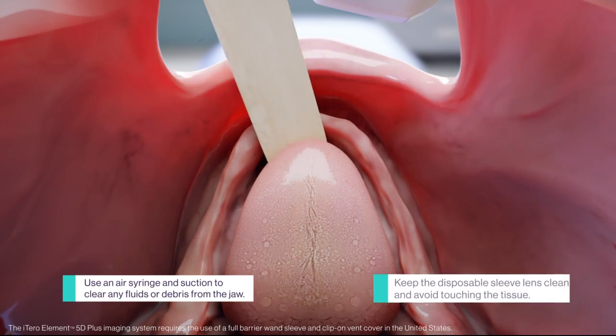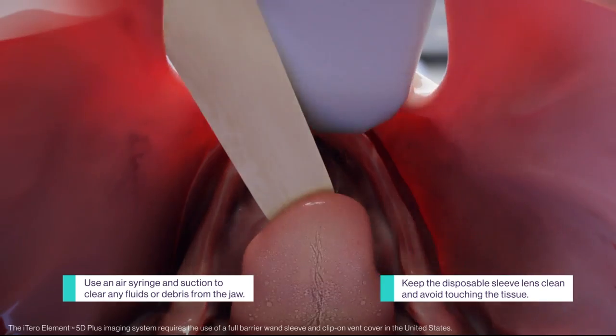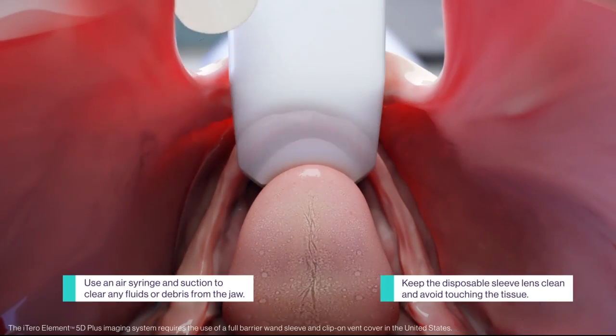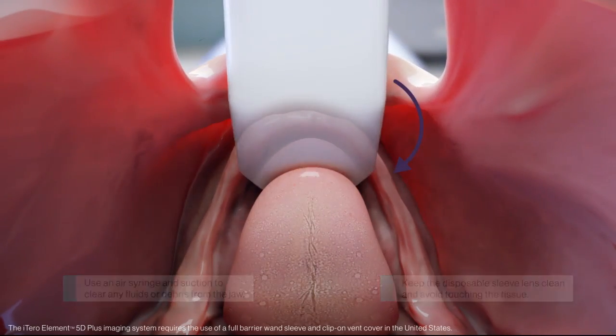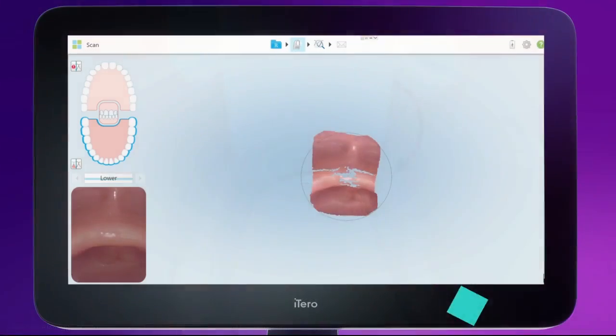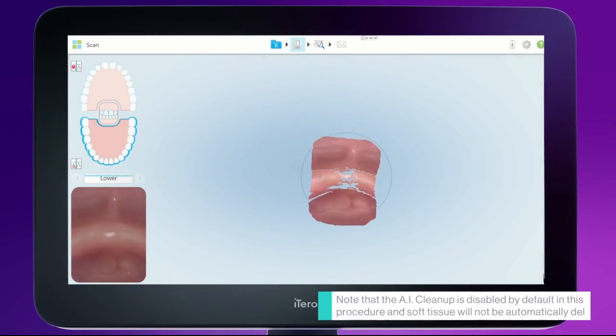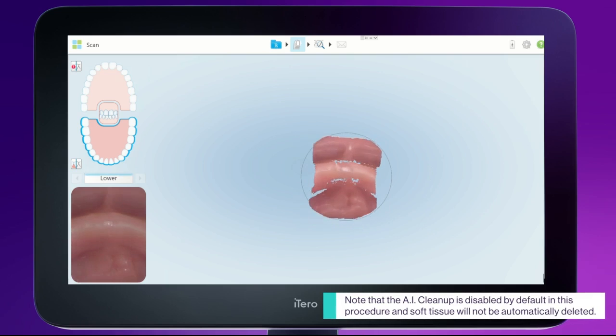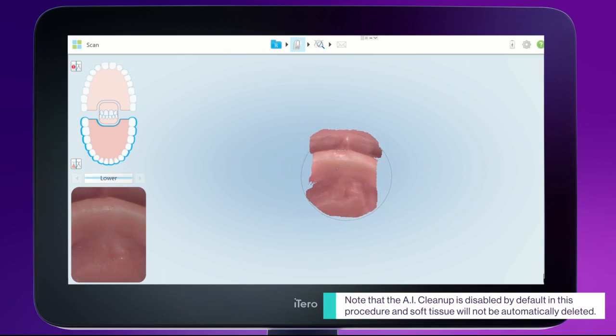Position the wand flat on the ridge of the midline, turn it on, and dip into the lingual. Capture the lingual frenum and anterior lingual ridge.